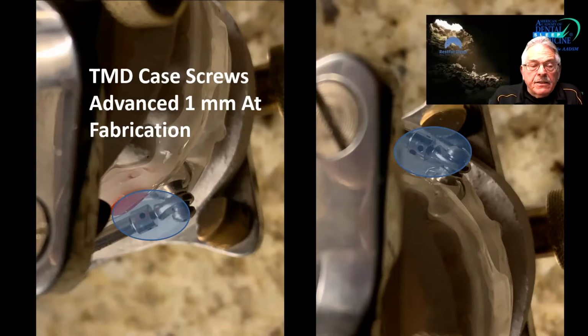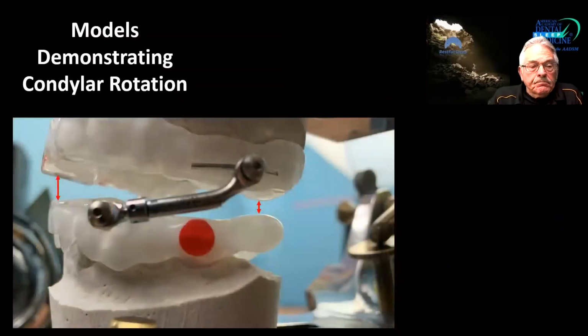I doubt I will, because I took a very, very conservative bite registration on it. First of all, she's probably not going to tolerate it very well. But second of all, I'm not going to need to titrate it very much because I'm just stabilizing the mandible to make it more effective for her CPAP. So we're maintaining the airway and then relying on the CPAP to keep it open. This demonstrates how condylar rotation will actually create more opening in the front than the back.